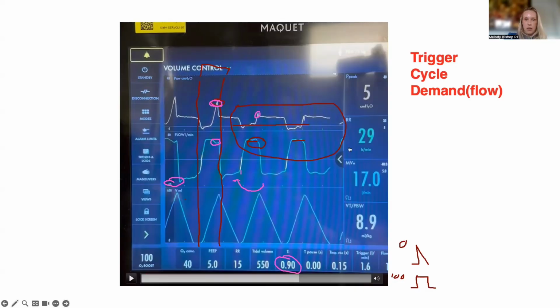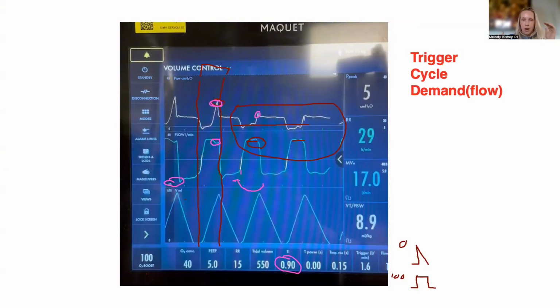I think right now you need to just allow, like the patient has so much active effort. You don't even have time to get sedation under control and try to settle. With this degree of auto peep, I would move right to trying to just let the patient do what they're trying to do. And I would probably just go to pressure support and then try, in tandem with giving them a bit more opioids and trying to settle them a little bit, to get them at least comfortable on pressure support for me to see what their intrinsic respiratory effort is.